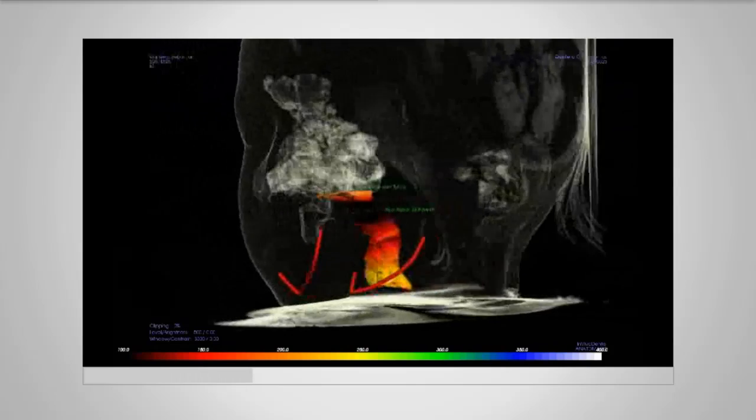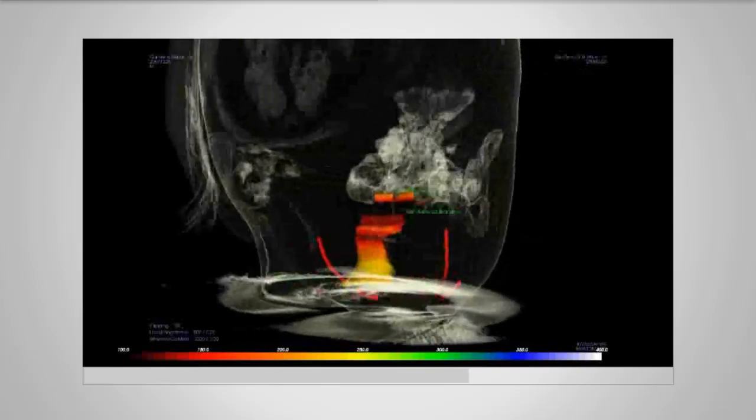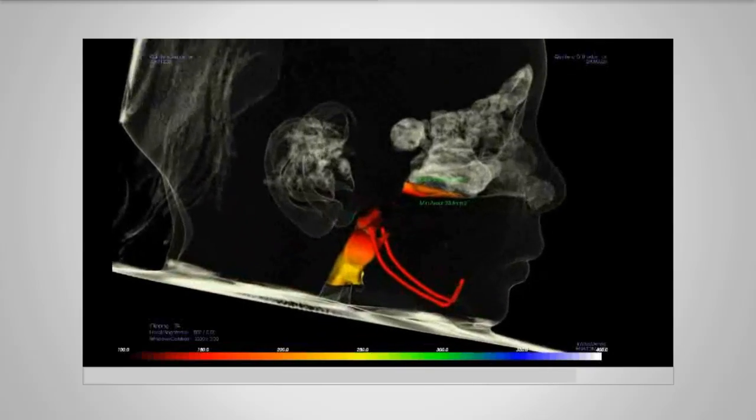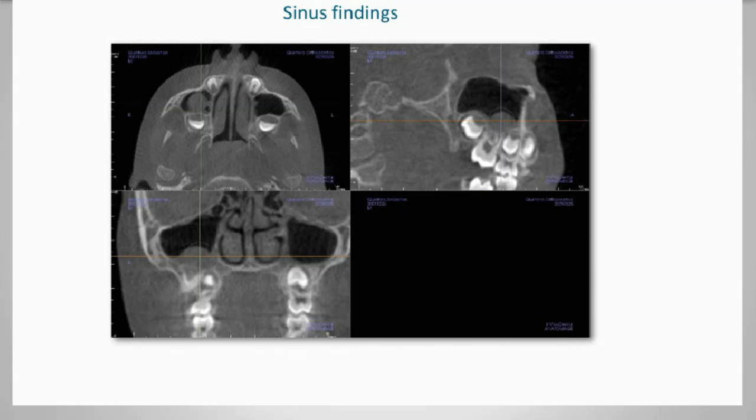Sometimes it's at the tonsils. Sometimes it's neither. And sometimes it's just because the mandible or the maxilla is back. So anyway, quick, easy reference. These visuals are great. We can do quick screening. We can help educate the parents about these things. Patients really understand. So this patient had a mucus retention cyst, which is very common, no big deal.